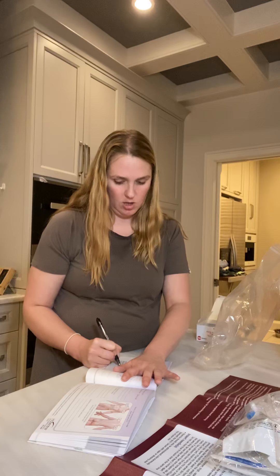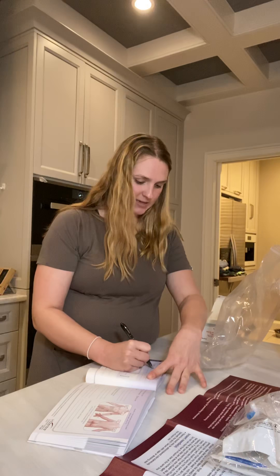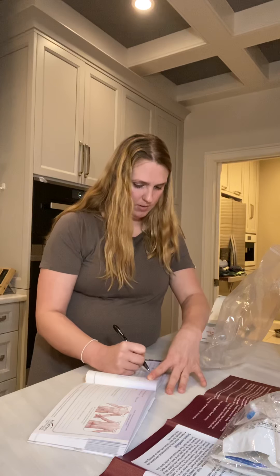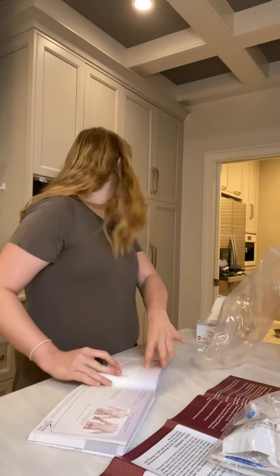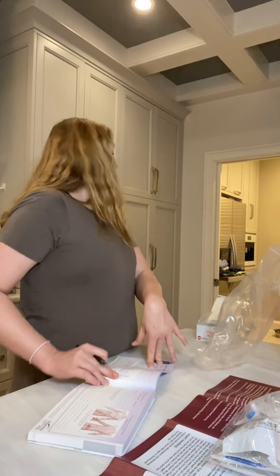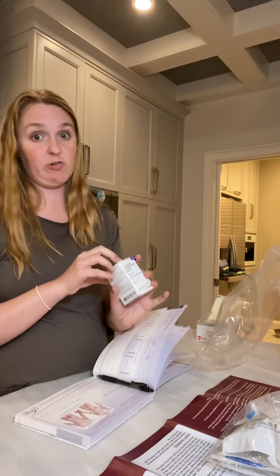You log the date — April 7th, 2020 — and you log the time that the infusion starts. I'm going to go with it'll probably be around 8:50. Then I'll also log the time it ended, and you log how you're feeling after the infusion and if you have any allergic reactions.